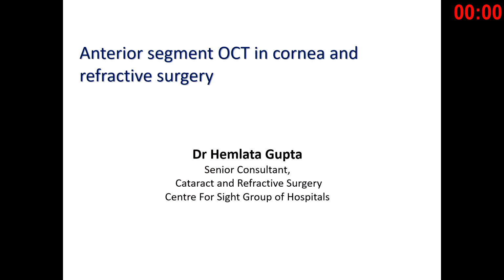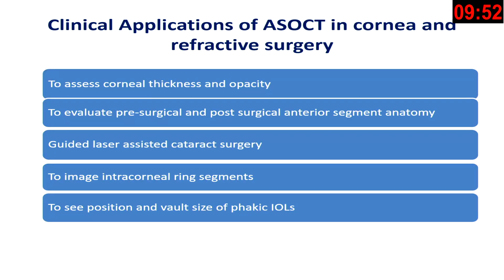A very good afternoon to all of you, and thank you, Dr. Dinesh sir, for giving me this platform to share my experience with anterior segment OCT use. So I'll be talking mainly about the clinical applications of anterior segment OCT in cornea and refractive surgery.